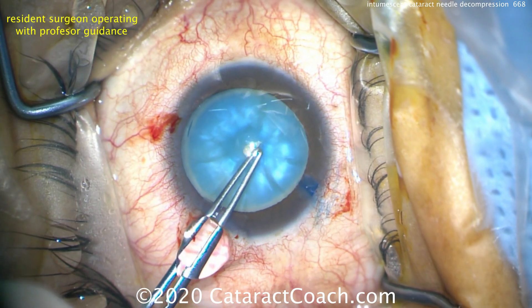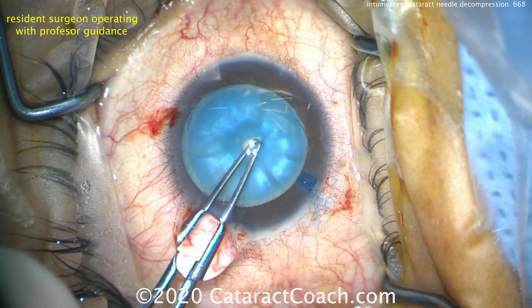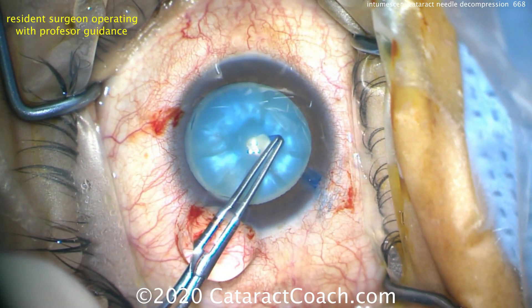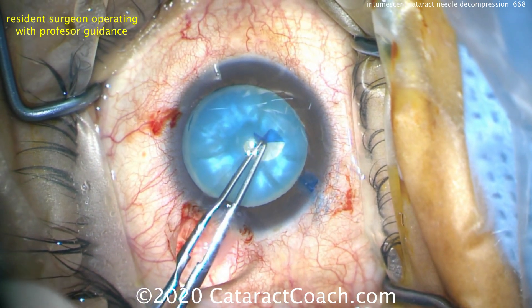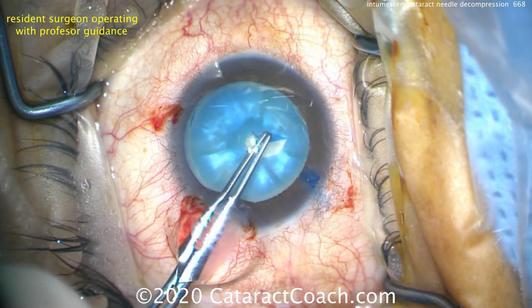You can see the anterior lens capsule has been flattened — it's not dome-shaped, it's completely flat or even slightly sunken in the middle. That'll make it a lot easier and give you a lot more control in the capsulorhexis creation. There's no urgency in rushing through this, no pressure, and if you leave things for a moment you don't get that automatic extension of the rhexis edge.